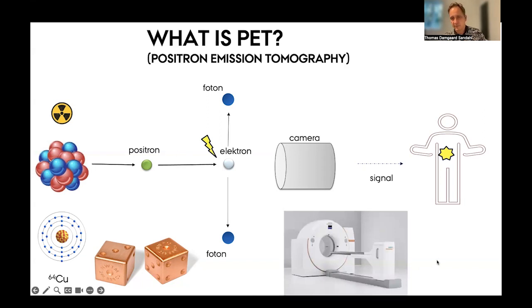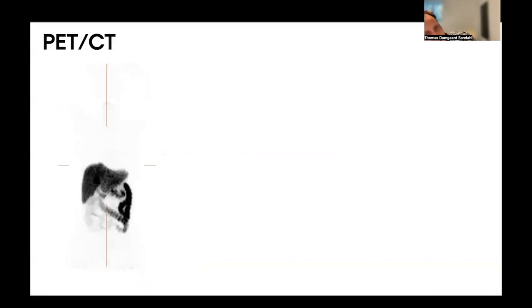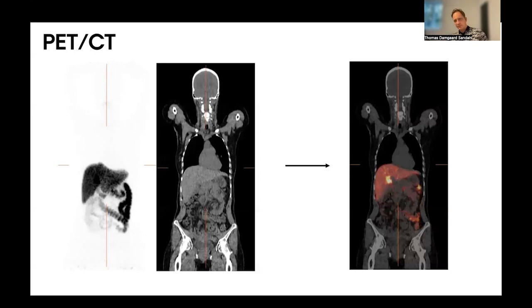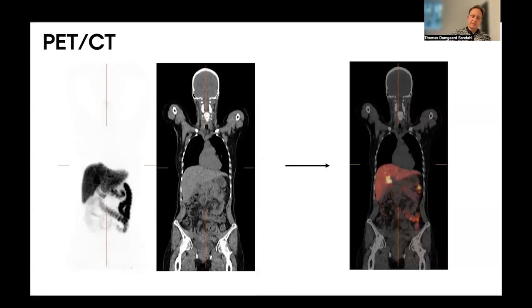The machine looks something like this, and for any of you who have been in a CT or MRI, this is very familiar. What we get out of it is, first of all, the PET signal, which is the actual detection of where the copper is. Here you can see a lot of copper going to the liver and also the intestine. We typically fuse it with an anatomical image that could be either a CT or an MRI. When you fuse those two images, you get something very beautiful — you can see exactly where the copper is going. You can also quantify how much is where and follow it over time: now it's in the liver, now it's in the bile, now it's in the kidneys or wherever it goes. This gives you both quantification and time-resolved resolution, making it very ideal for copper metabolism investigations.